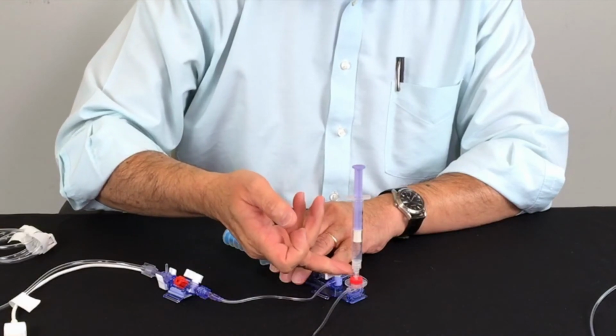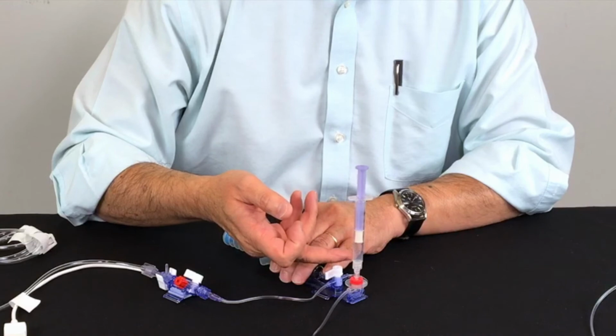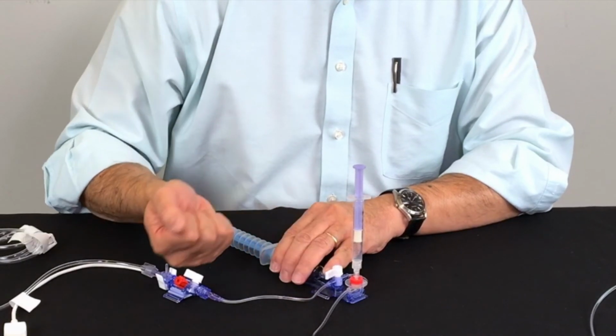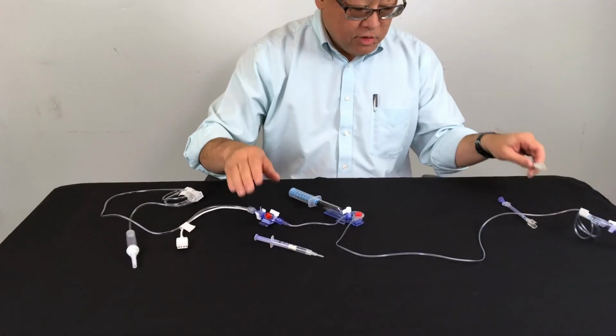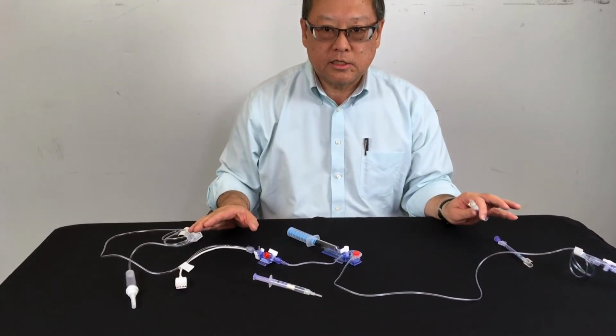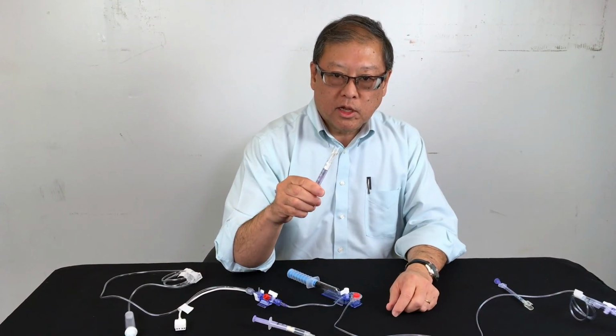Presetting the plunger, allowing the sample to then automatically fill into the syringe with the air inside the barrel venting out.